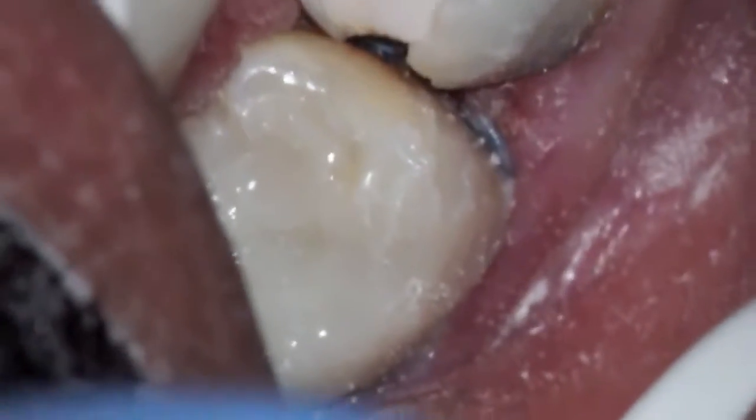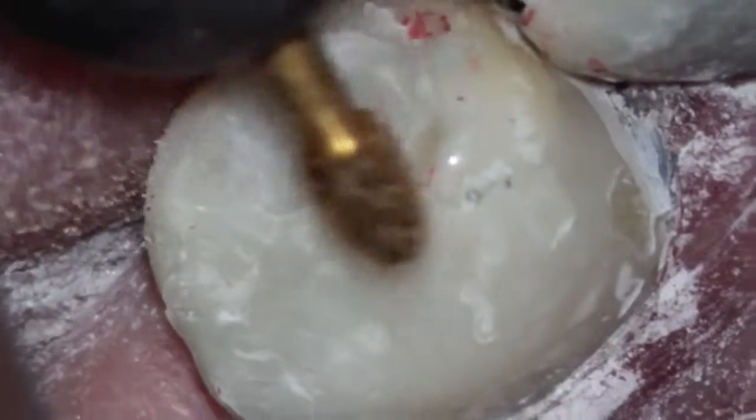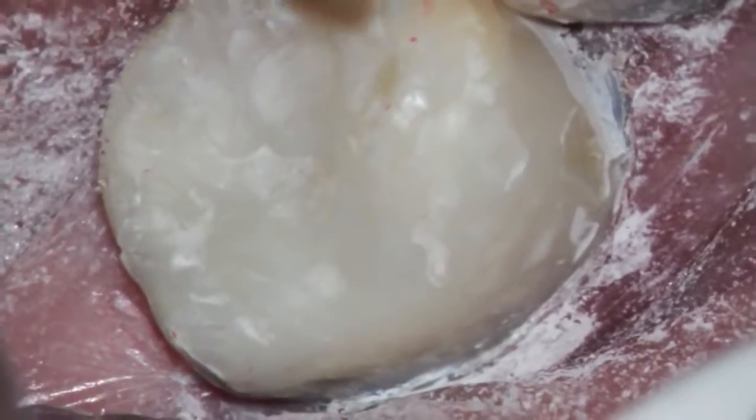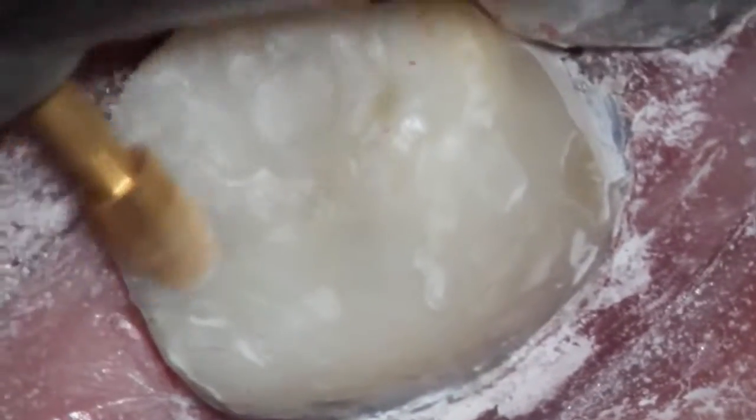The next step is to place the composite, polish it, make sure the bite doesn't hit that filling too hard, and there's the harder filling, trying to contour it the way that the tooth would function the best.